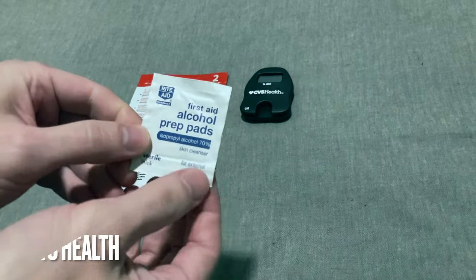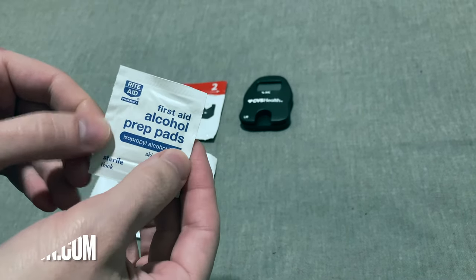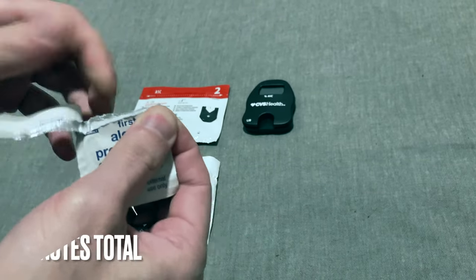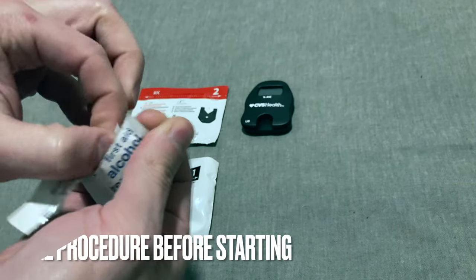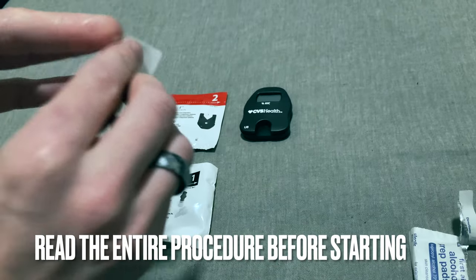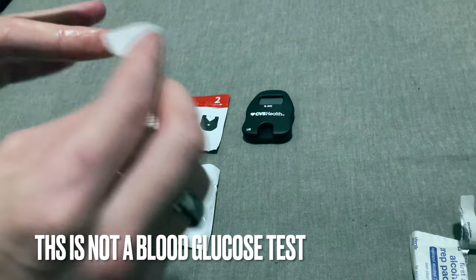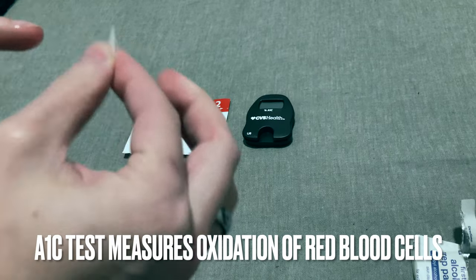All right, to start with, we're going to use an isopropyl alcohol skin cleanser here. And you can see we got these from Rite Aid. The idea here is when you pull this open, this foil-lined paper pouch can be used to sterilize your fingertip. I'm going to use my middle finger here, like that, both for comedic effect, and might as well just clean the whole thing while we're at it.